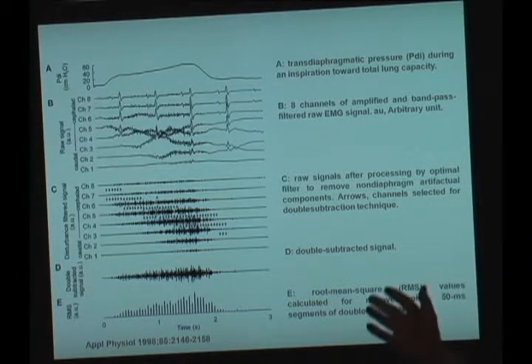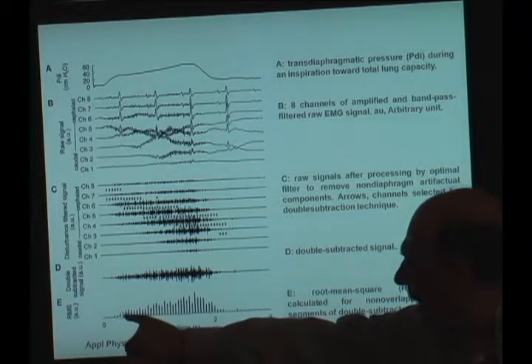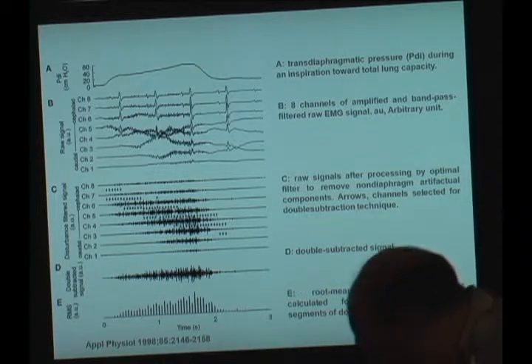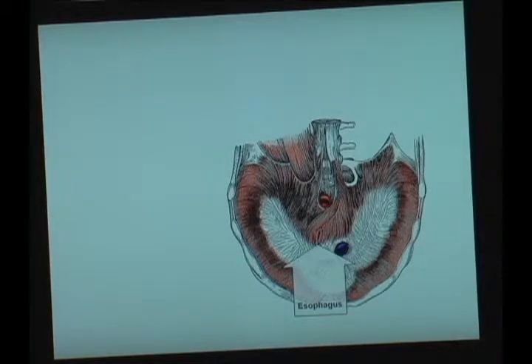It is allowed to have a signal like this, and the shape of this signal represents the EAdi signal that could pilot the ventilator.